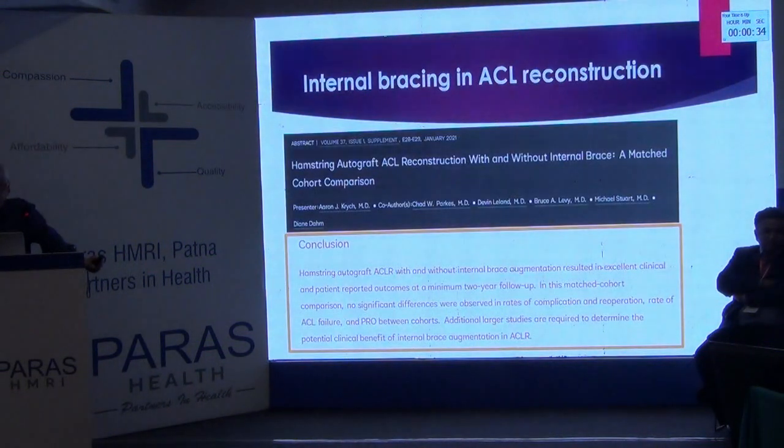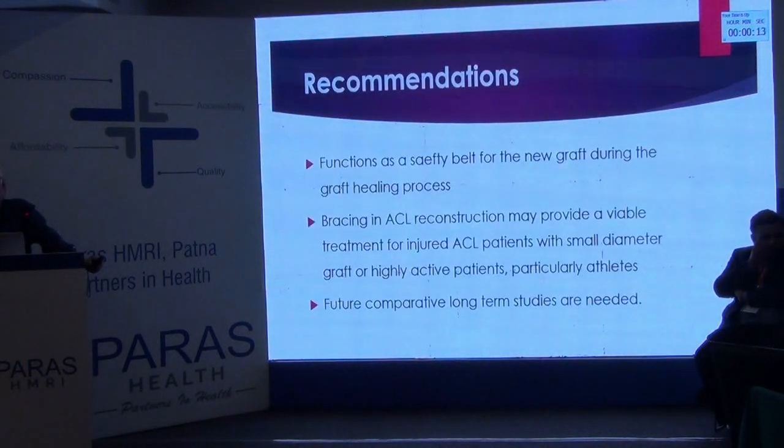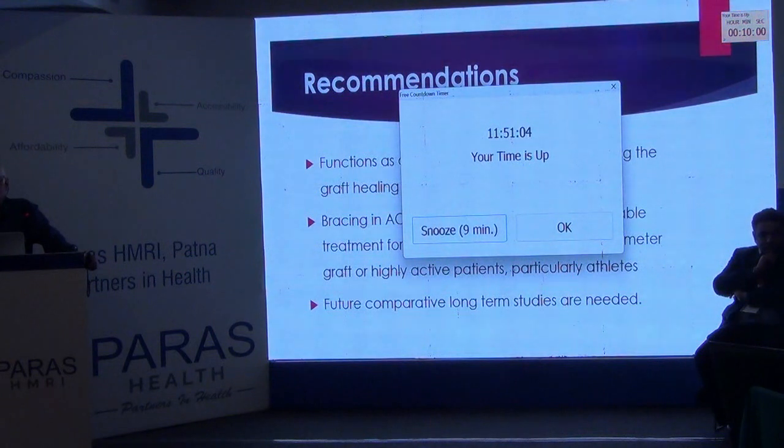And again, another topic of controversy in ACL is the internal bracing. Though we are doing it in almost all the cases, again there are studies which show that it compresses the graft, but usually if you tension the fiber tape at a slightly different tension, we make it a bit loose, so it works. So the broad recommendations are that it functions basically as a safety belt for the new graft during the healing process, and it provides a viable treatment for the patients with the small diameter graft or highly active patients. And I'll take 1 or 2 minutes to finish off.